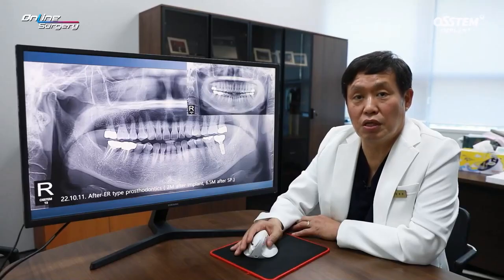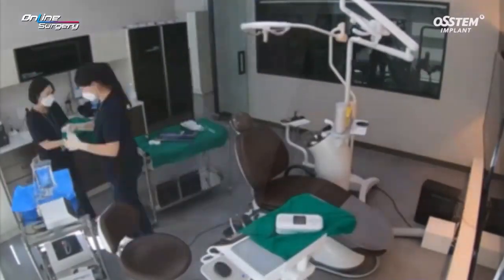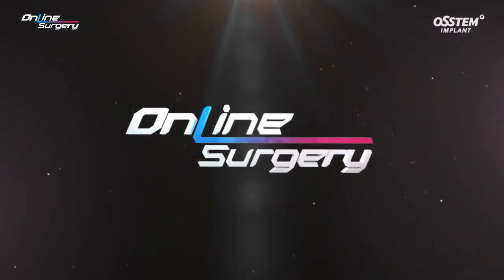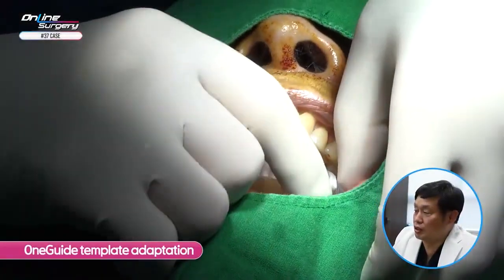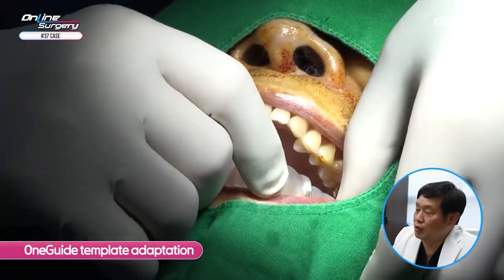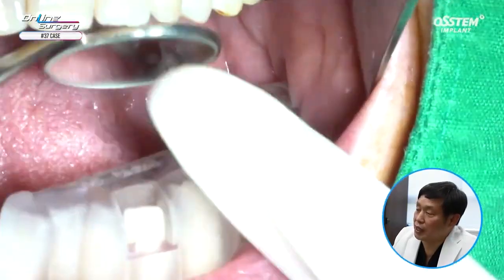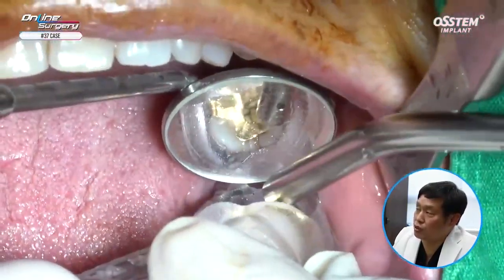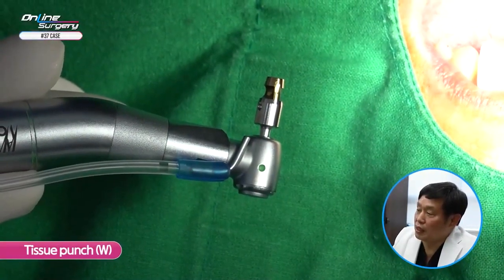Let's look at the surgical clip. As you can see, OneGuide template is adapted. I'm checking the adaptation. It fits very well. If you look at the distal side of the mesial tooth, you can see that it is fitting nicely.